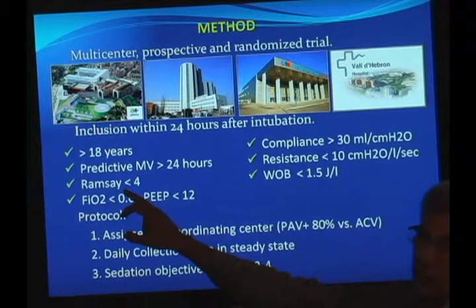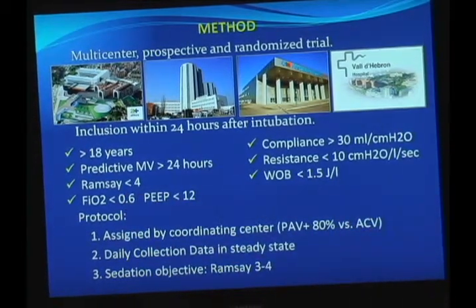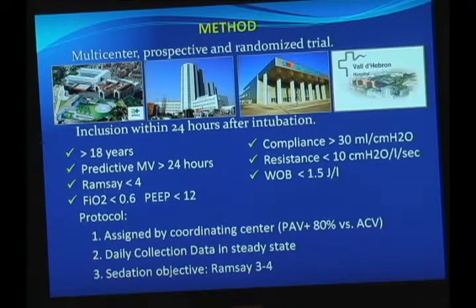Also, we needed for sure that they were not in deep sedation, because then they are unable to trigger the machine. And also, because of our previous studies, we selected patients with compliance not terrible, without enormous resistance troubles, and who don't develop this enormous amount of work of breathing.